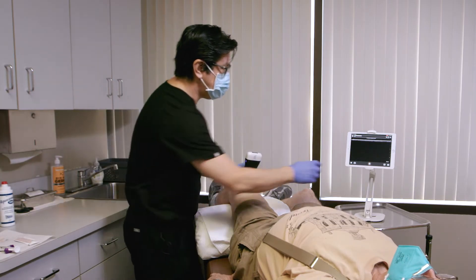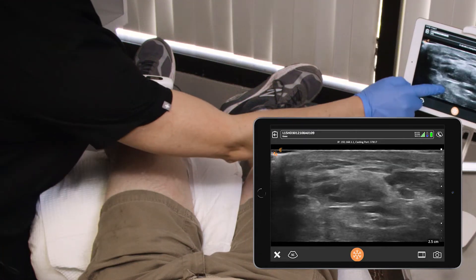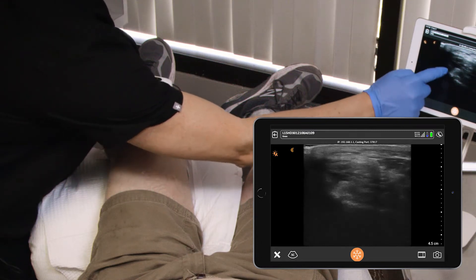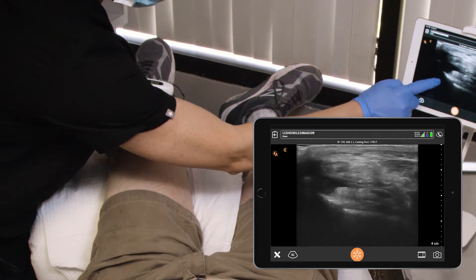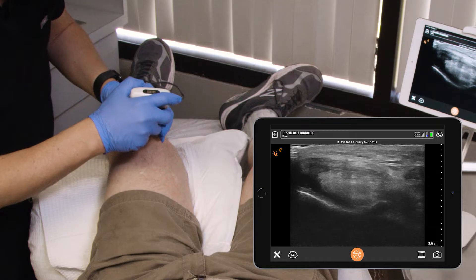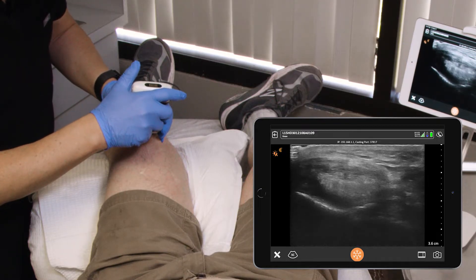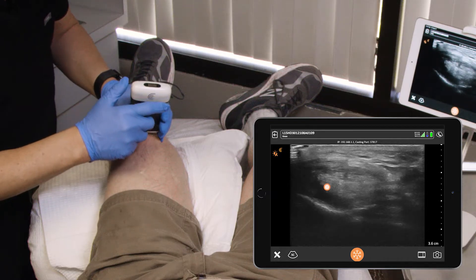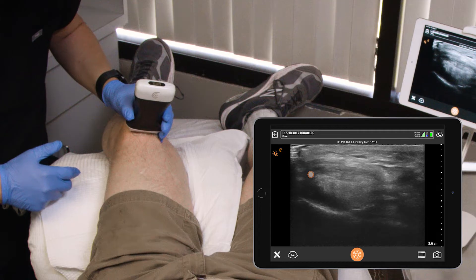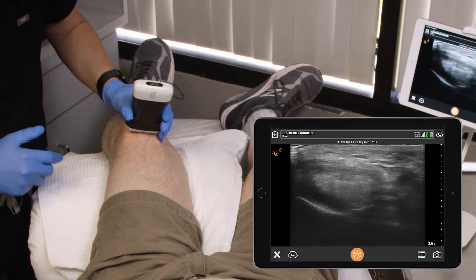First, I'm going to just check out the knee. Take it off freeze. Take a look down. Got to go a little bit deeper to be able to see. We're going to increase the gain so I can see better here. There I see him very nicely, and we can see very well. He does have an effusion, so we'll be able to give an injection directly in that effusion. You can see it's about 1.5 centimeter entry point, then angled slightly down to get into it.